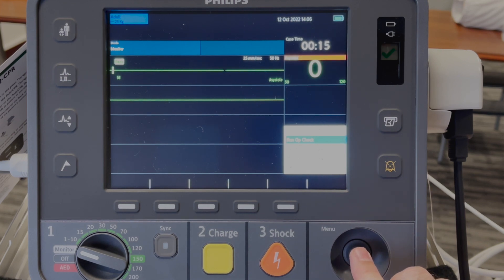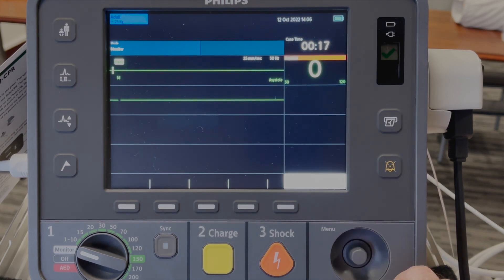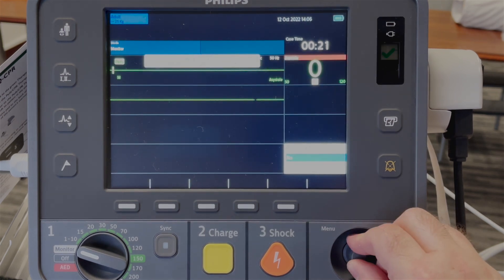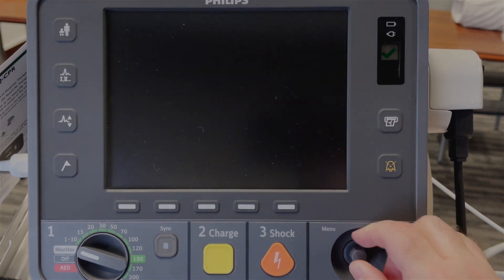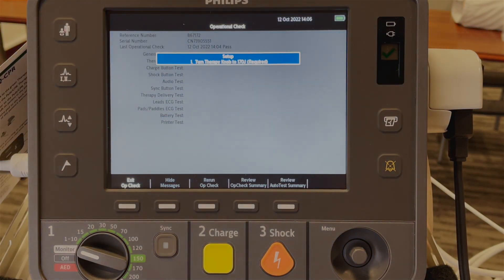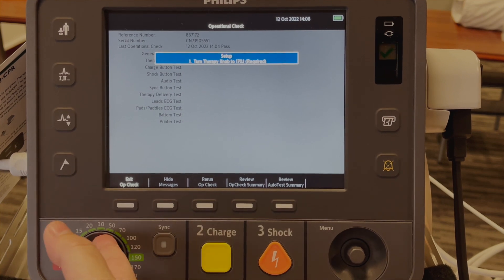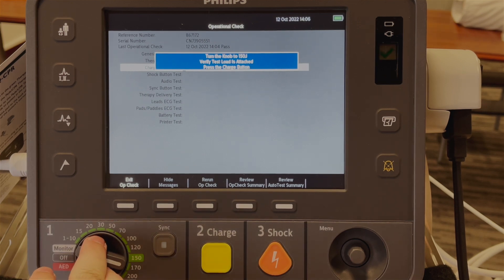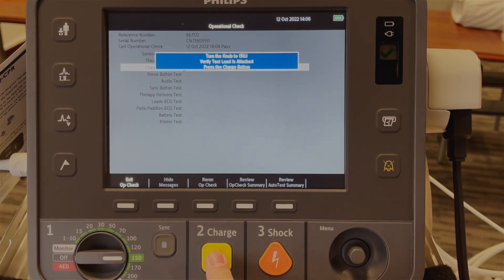It will ask 'Run operational check' — select that. It will ask to exit clinical mode — select yes and follow the commands on the screen. Select 170 joules. It then asks me to turn the button to 150 and press charge.